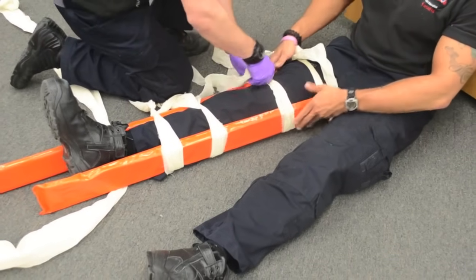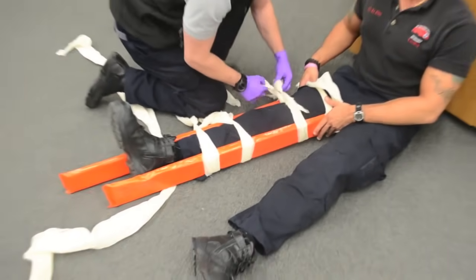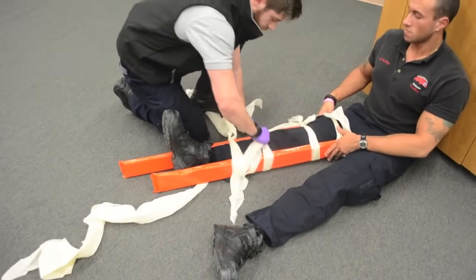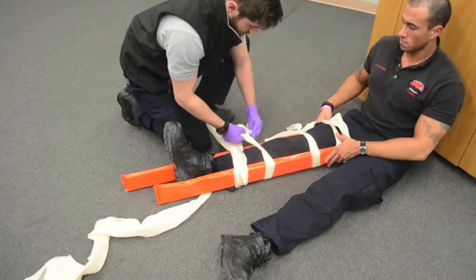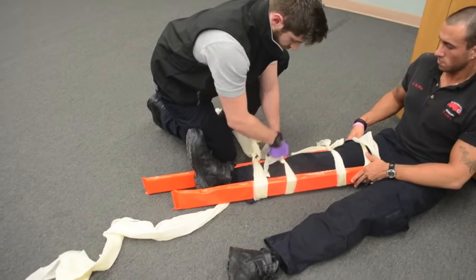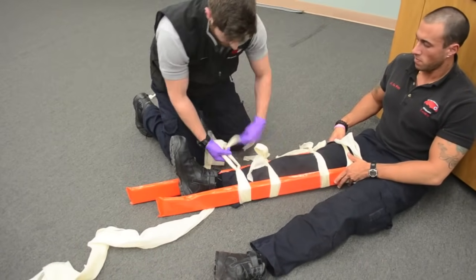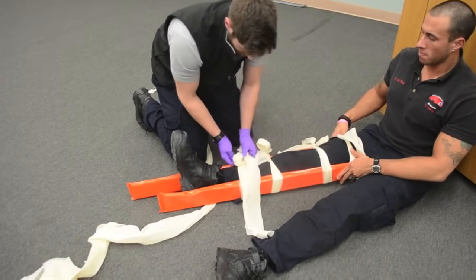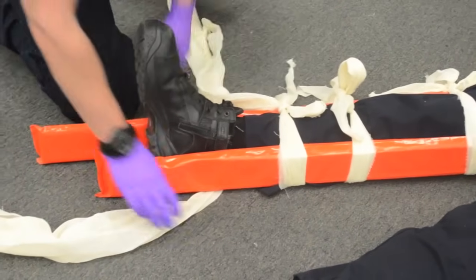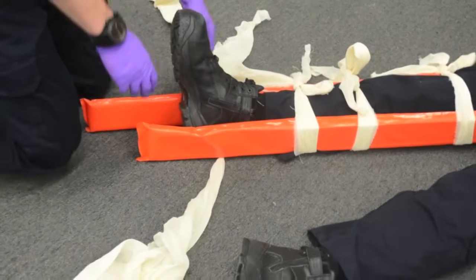I am going to go back down one more time just to make sure they are all tight. And lastly, make sure the foot is secured in the position of function.